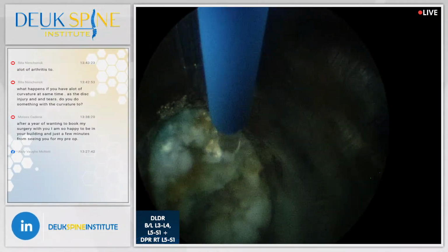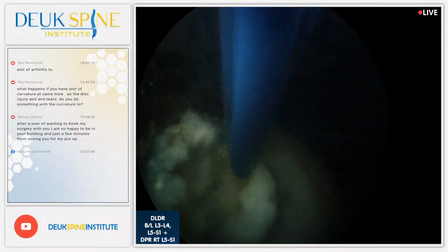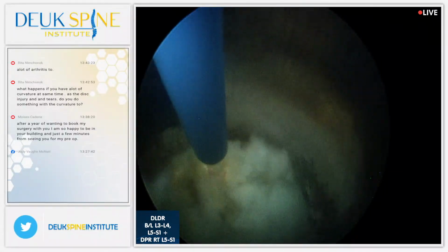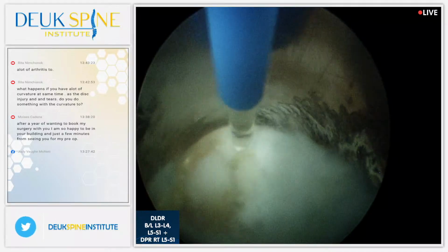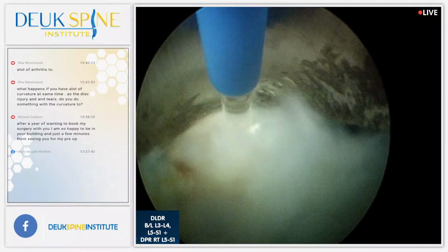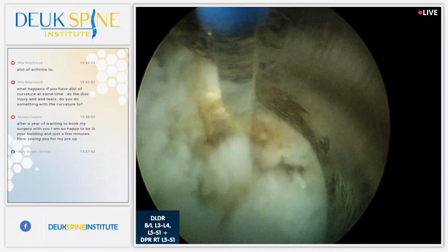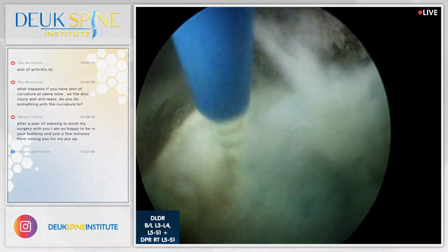And I laugh about people who say, oh yeah, the laser can't remove bone spurs. Well, the laser melts steel with just one blast. What do you think 100 blasts would do, right? Yeah, we can get rid of bone spurs quite easily. That's just people who don't know anything about lasers talking about lasers. When they say lasers can't remove bone spurs, they can.